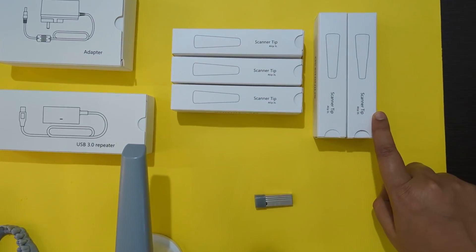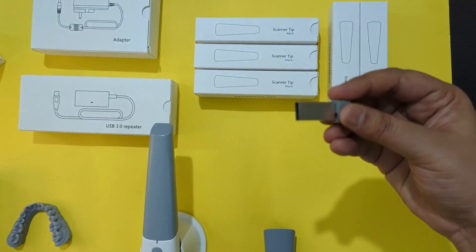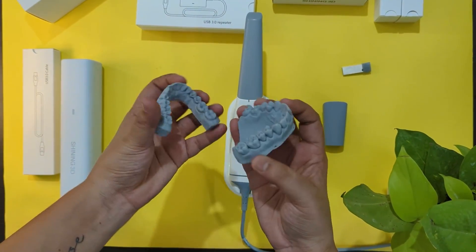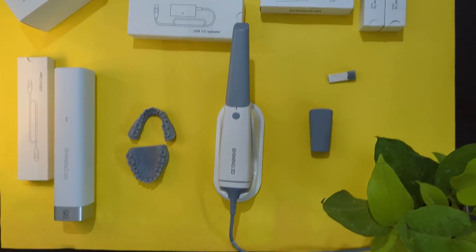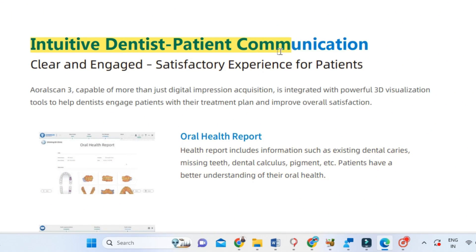The scanning software comes on a pen drive — we just plug it into our laptop, install it, and it's ready. There are also two practice models included on which we can do scanning practice.